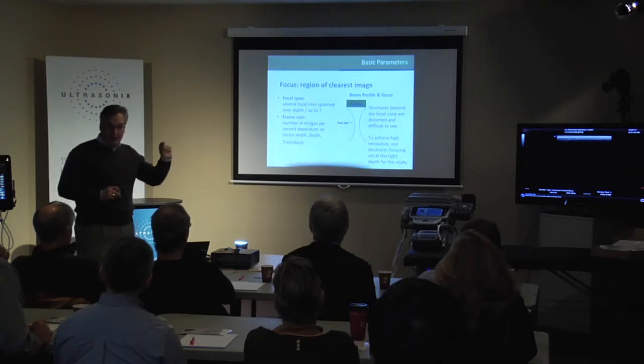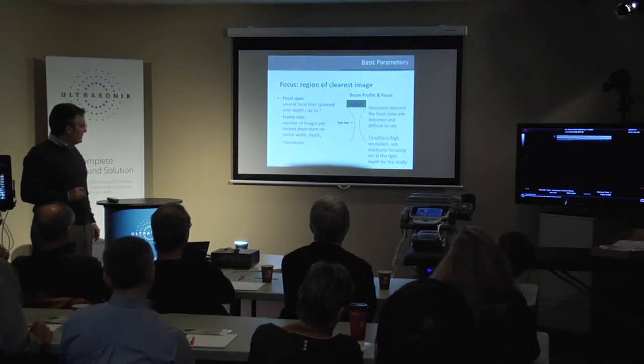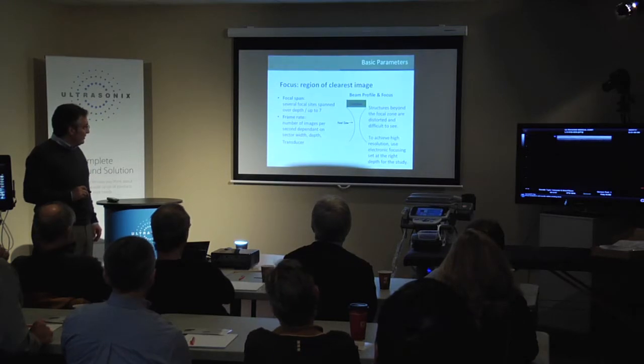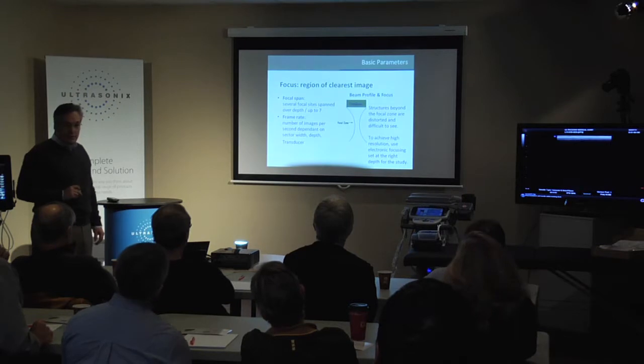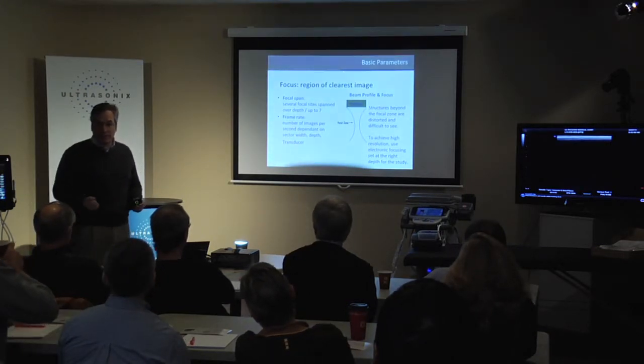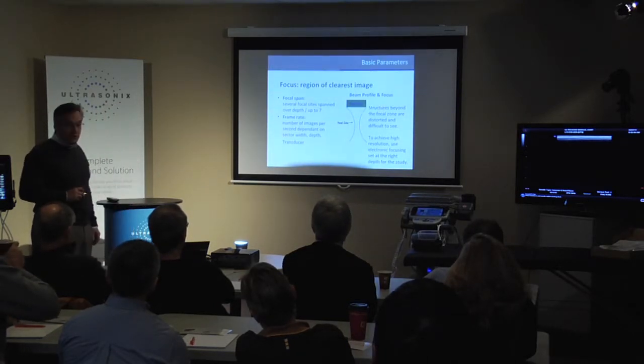The resultant effect is that we have more control, or better control, if you will, of the axial resolution from skin surface down into body listening for echoes. And because this enhances the electronic steering and display of heightened resolution with respect to the thinner hourglass appearance of the mechanical focus, I often just summarize this as a belt around the waist. The tighter the belt, the better you look. So you can control the display or placement of the focal zones and move them into the near field or far field.